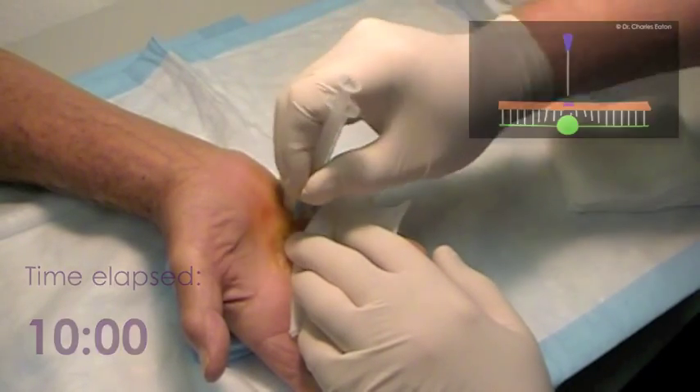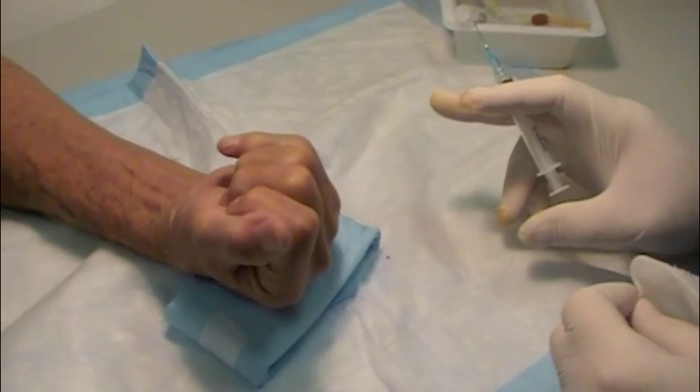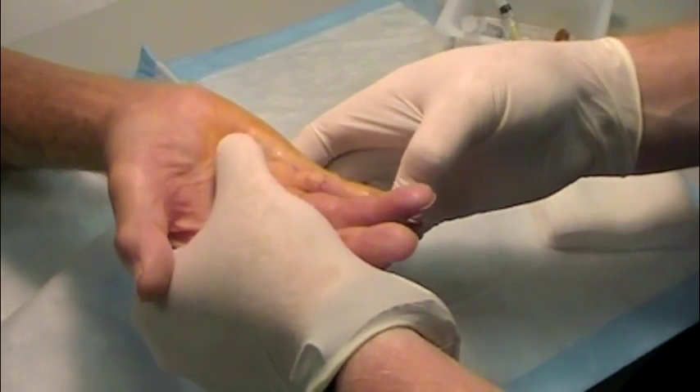We assess the degree of correction or straightening by having you extend your fingers as much as you can. I assist in stretching to release the final strands of the Dupuytren's cord.